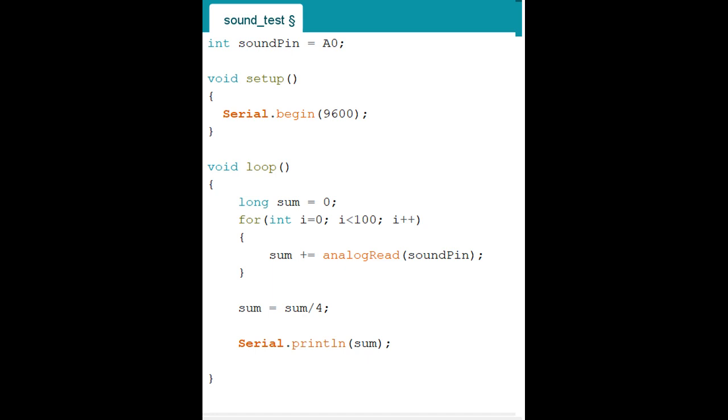And then press enter and then put braces, and then we give an indentation, and then you can say long. Long means it's going to be long. The digits are going to be long. It can be like a million or billion, so it can be a long digit. So I'm telling the computer, hey, it's going to be a long digit, just prepare, right? And then space sum. I'm going to call this sum because it will be summation. Right? So I'm assigning sum equals 0 and semicolon.